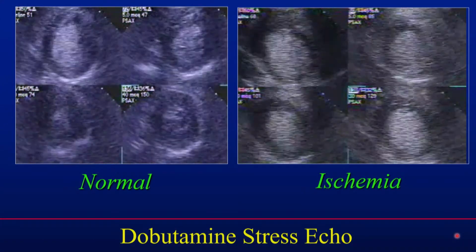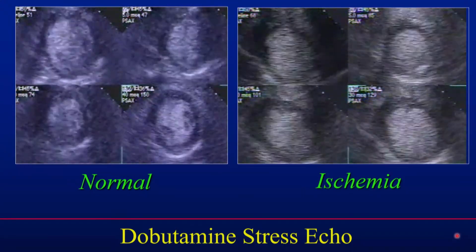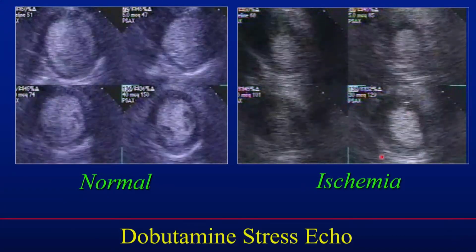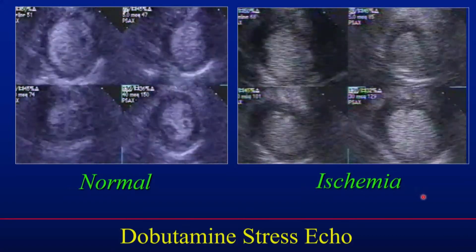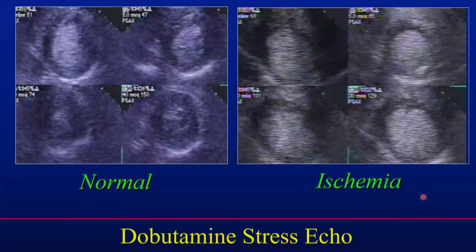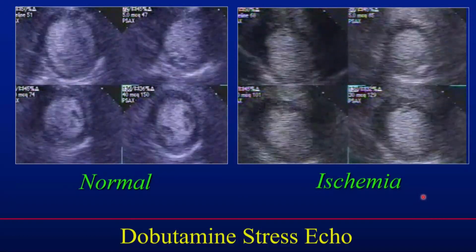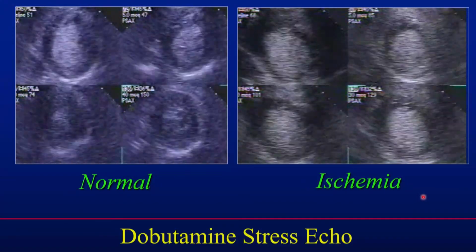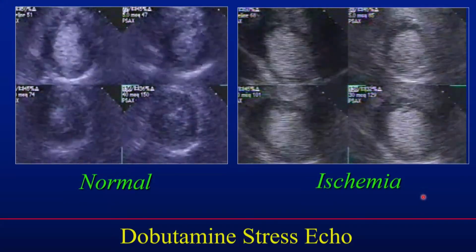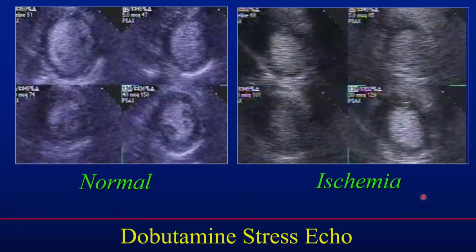This is from a study that we did on stress echocardiography. Another thought or piece of advice: you have to make that decision to use contrast before you go through stress. So, do I use it, yes or no? That way all the images are with contrast, which makes the interpretation much easier. Err on the side of more use as opposed to less use, unless the images are really pristine.